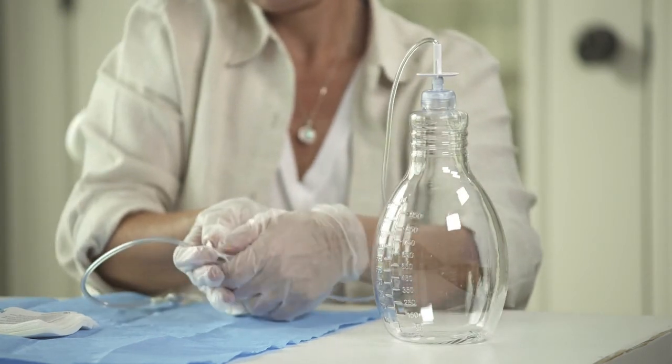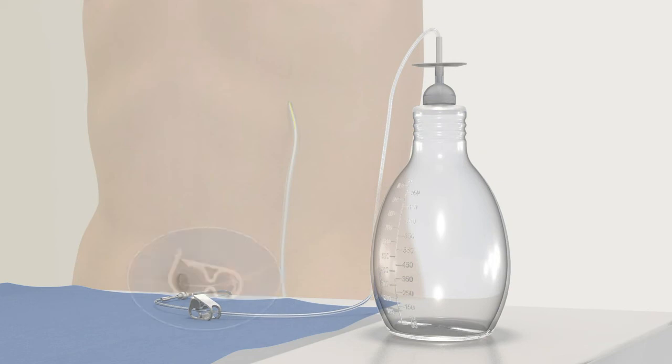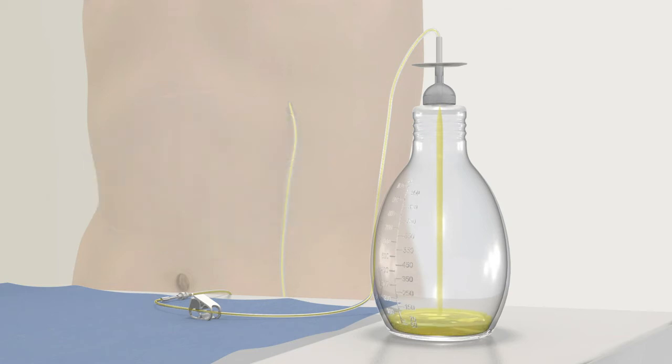Remember that the white clamp on the drainage line is still closed. To begin draining, slowly release the clamp. Fluid will start to flow into the vacuum bottle. You can adjust the flow by squeezing or releasing the pinch clamp as desired. Drainage usually only takes 5 to 15 minutes.